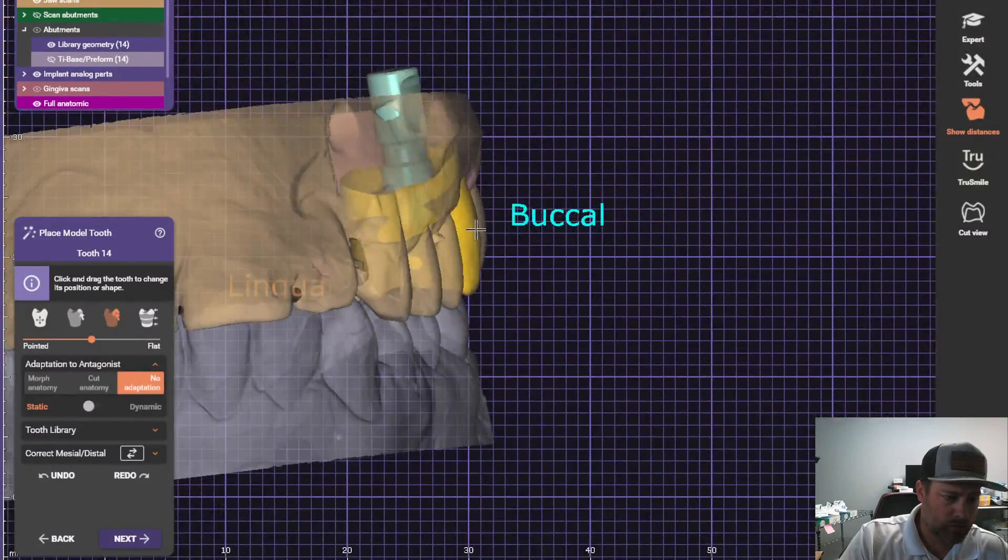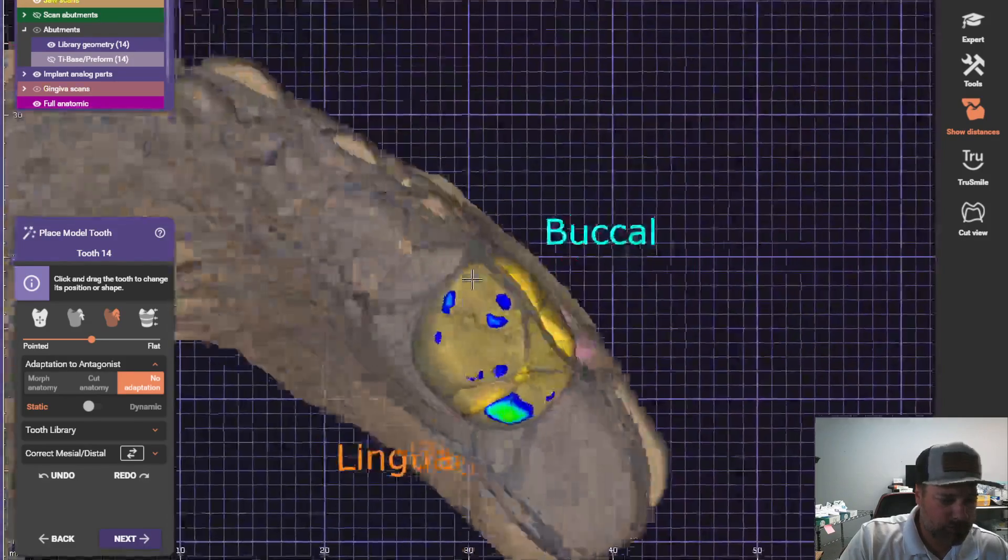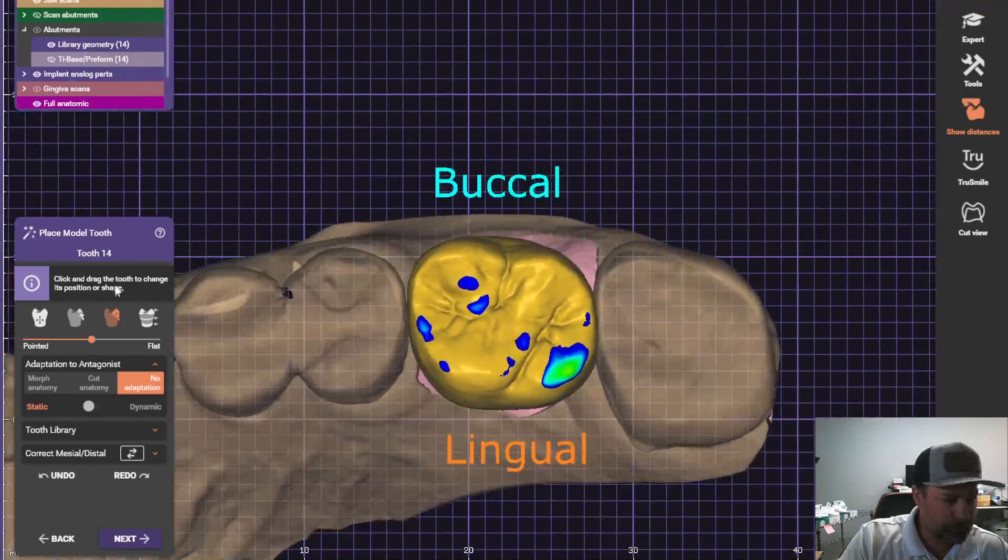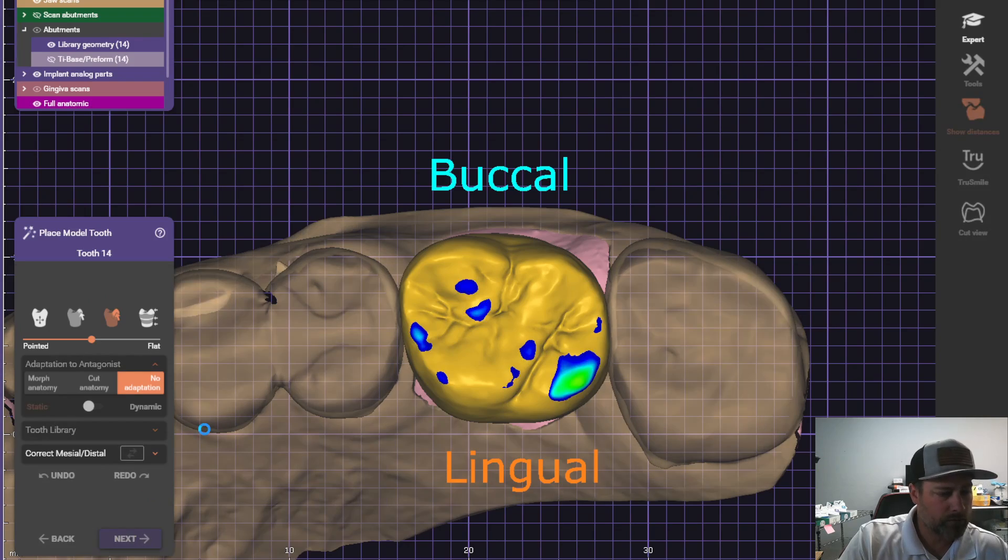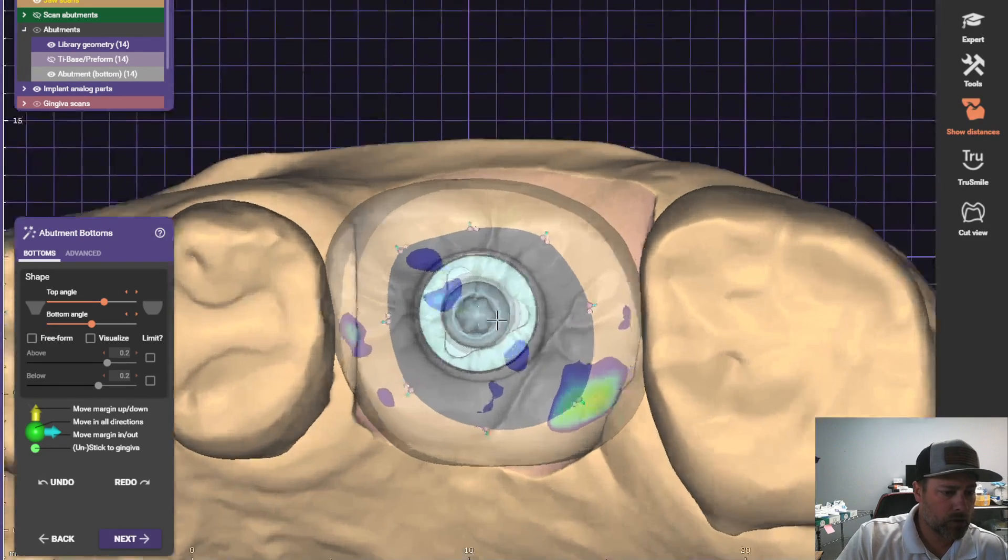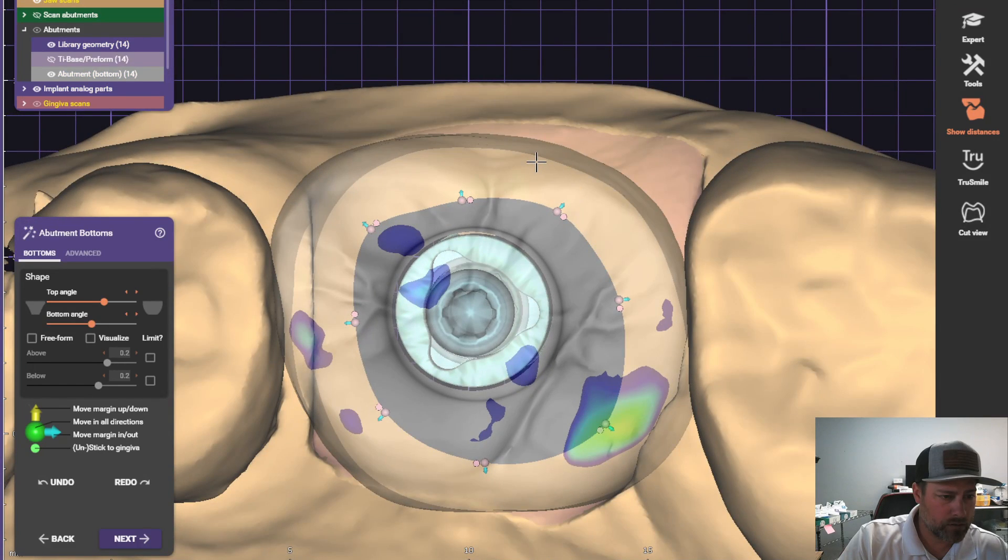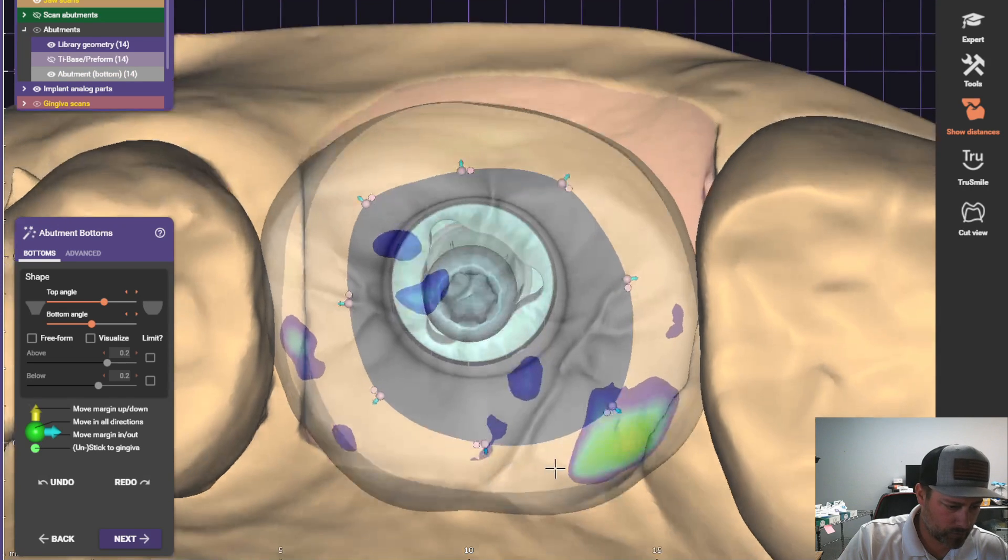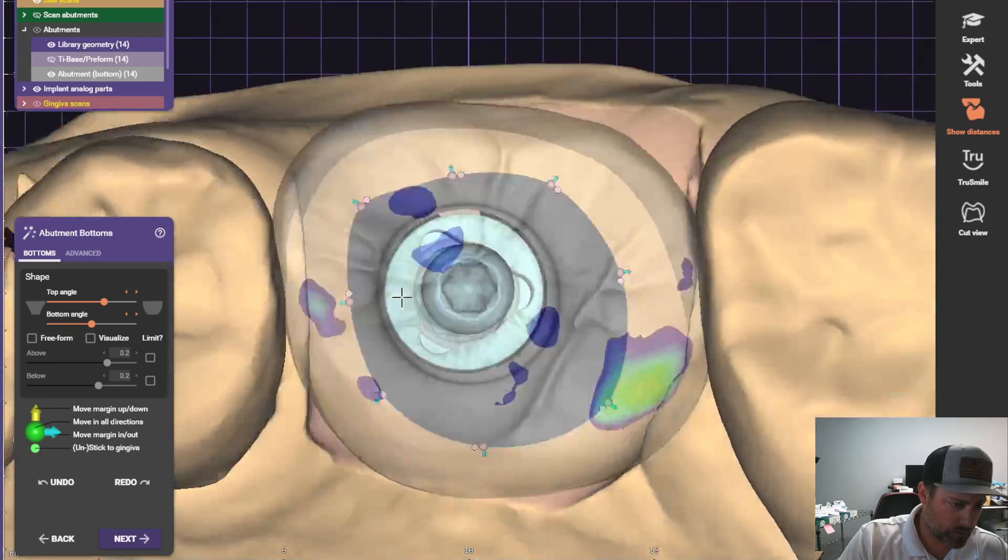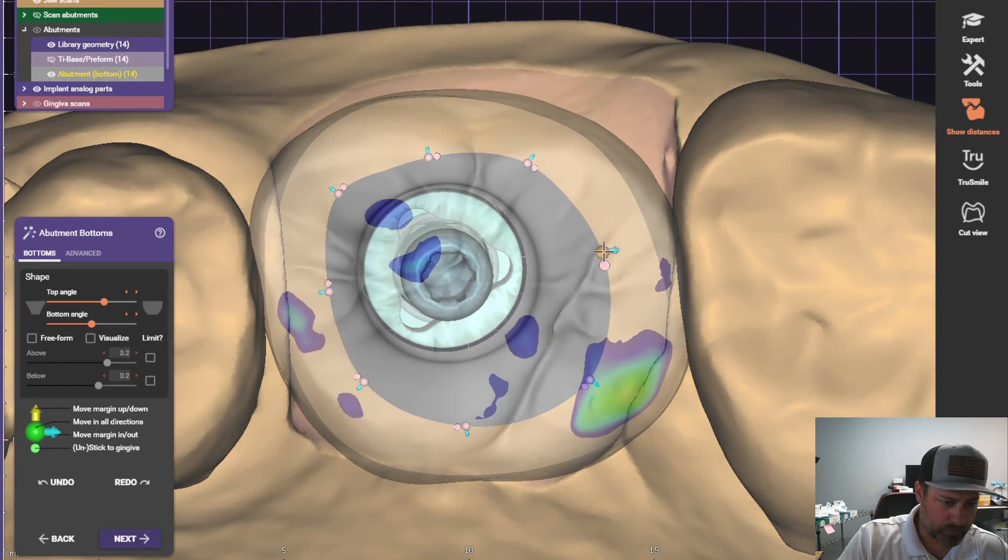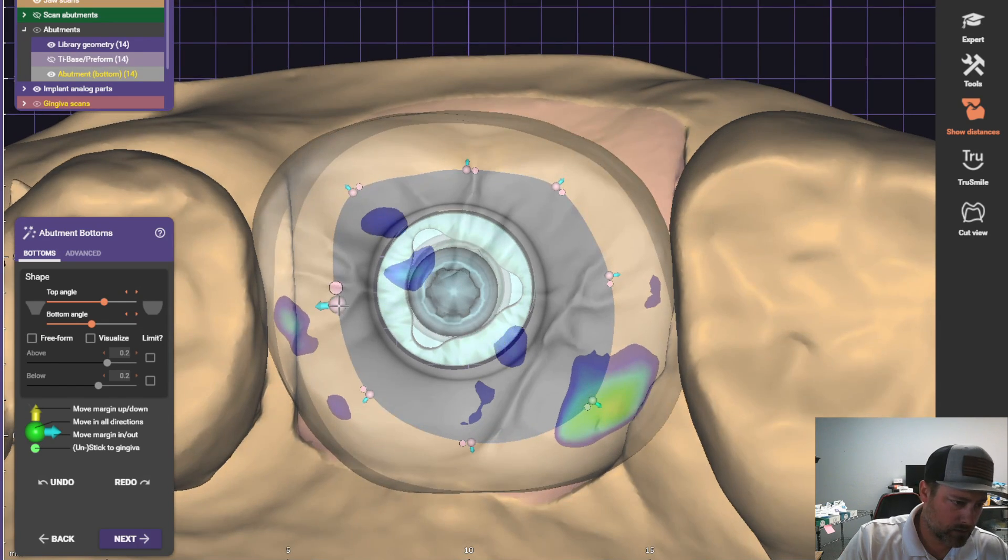Okay, now we have our ideal tooth shape, and now we can design our abutment. I'll use this blacked out and grayed area right here as kind of like my guide for the margin design right here. So we kind of want to make it look a little bit like that.